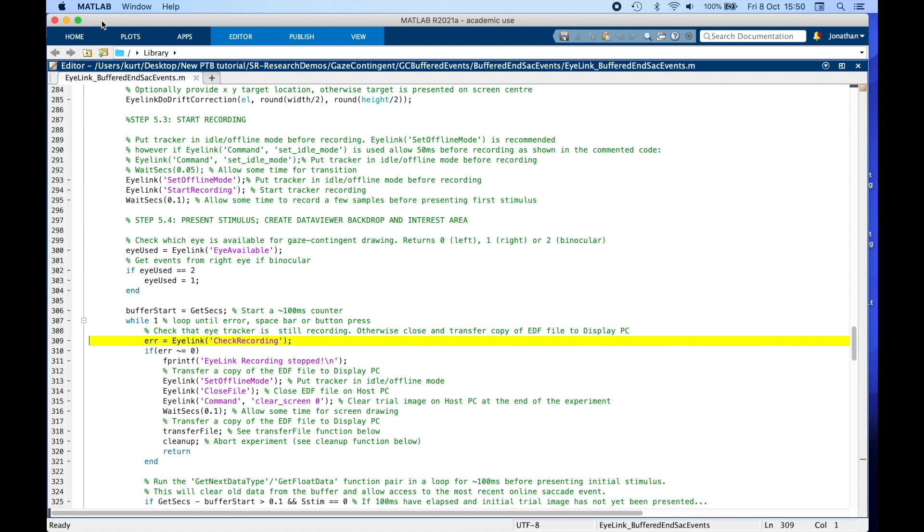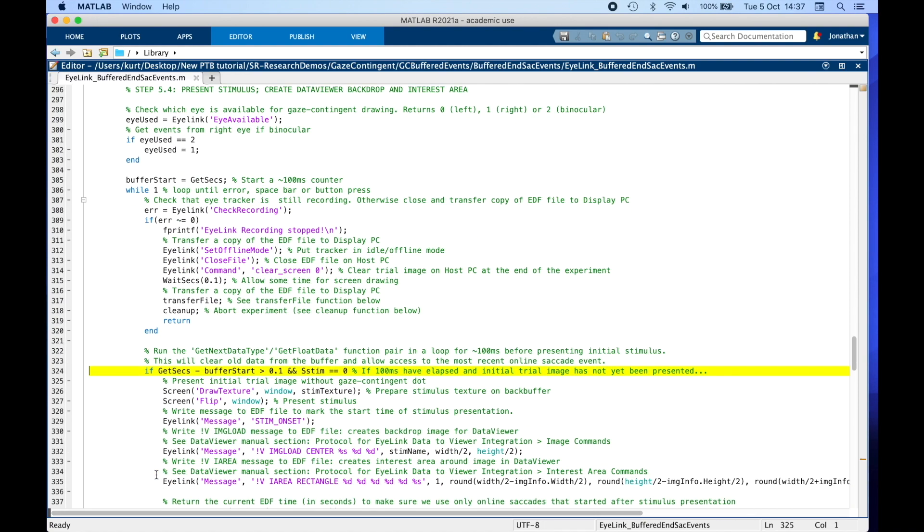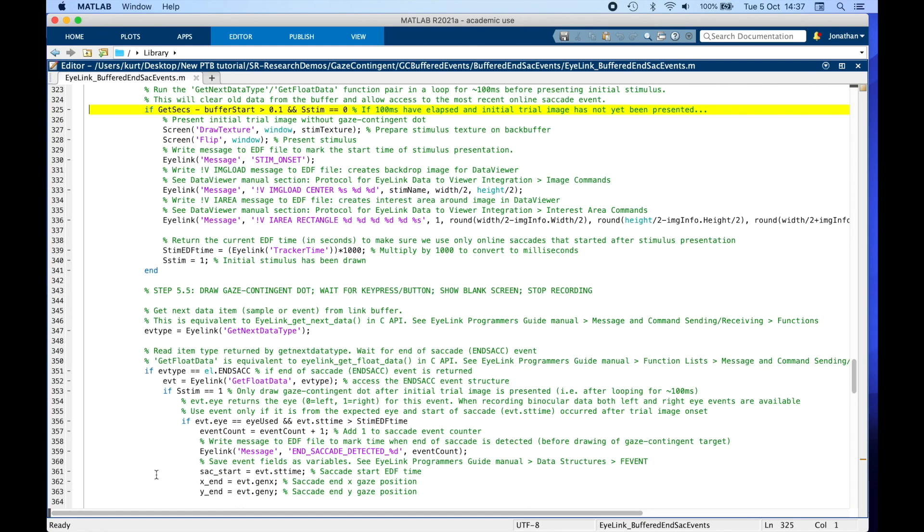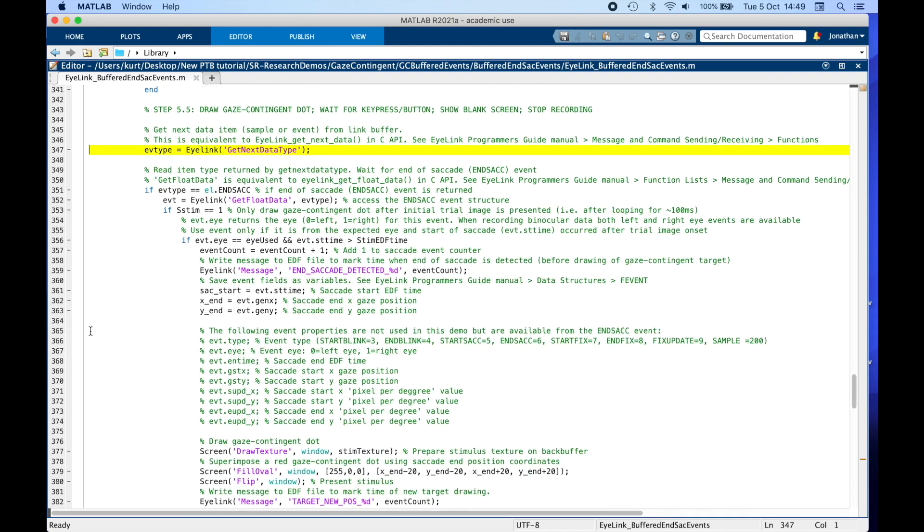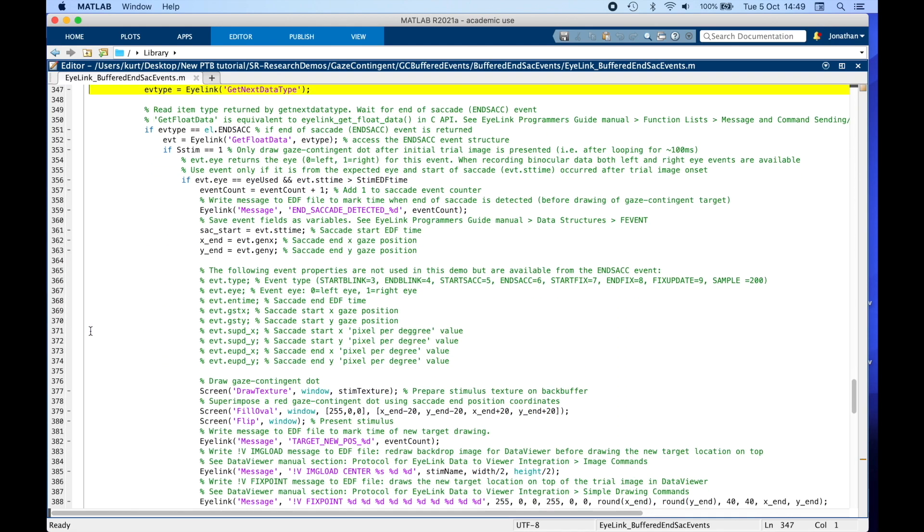We are going to check if the item in the buffer is an end of saccade event. Here, we check whether 100 milliseconds of looping have elapsed, so we can present the first stimulus. In the meantime, we call the EyeLink GetNextDataType EyeLink GetFloatData function pair to start consuming items in the buffer and catch up with the current item.